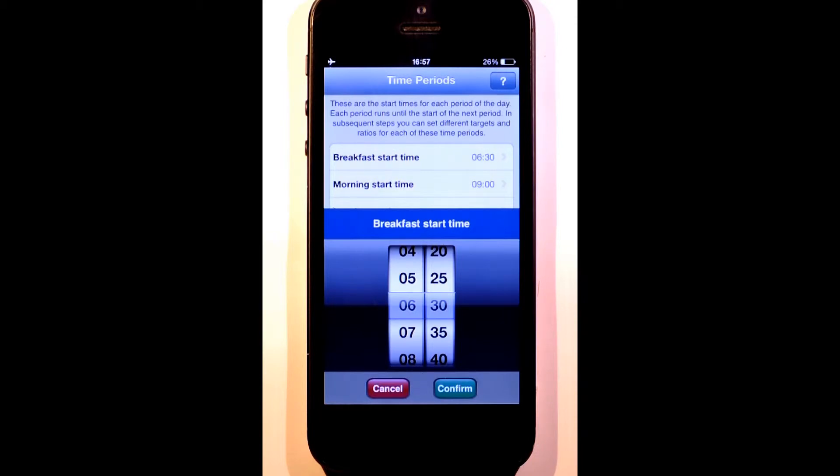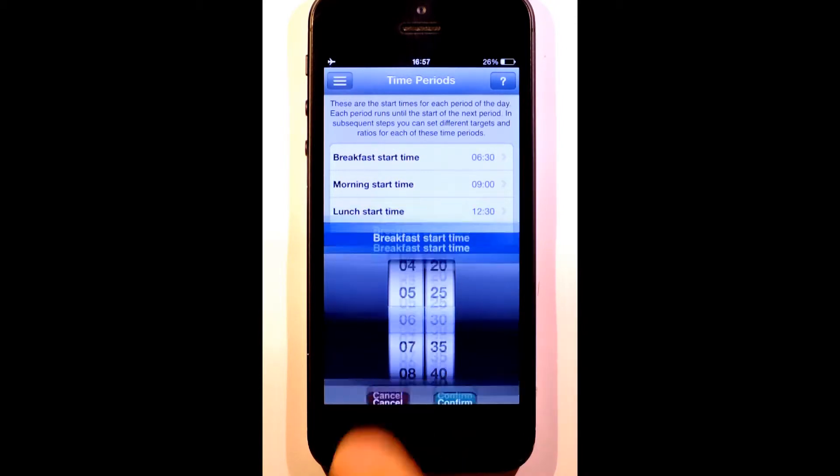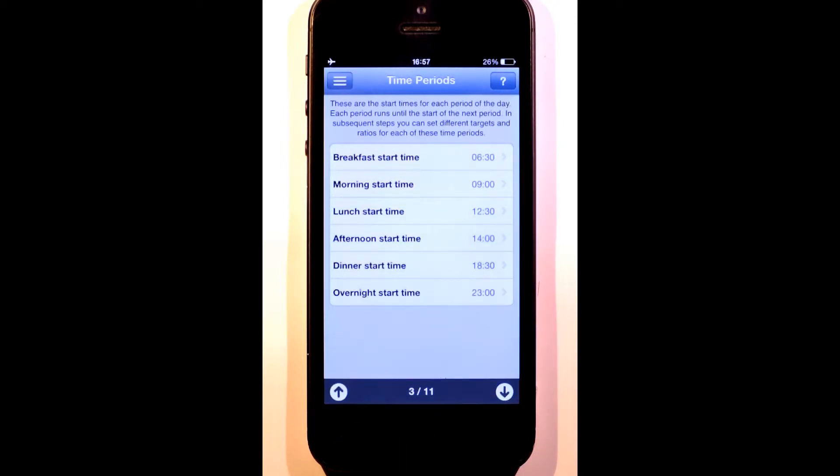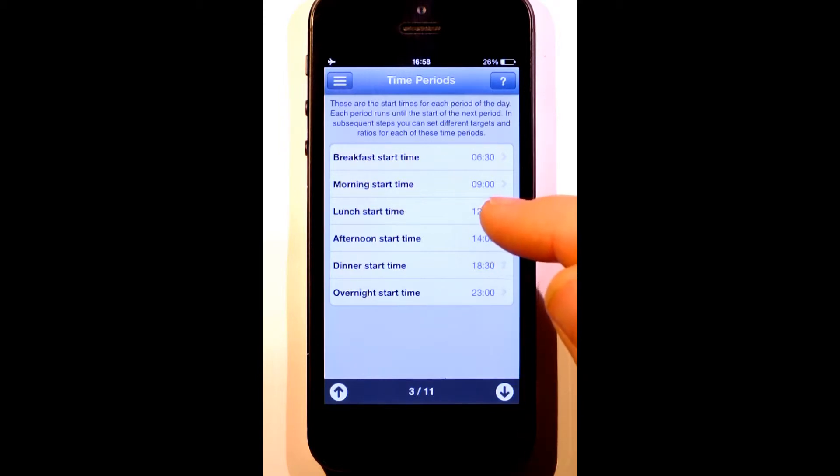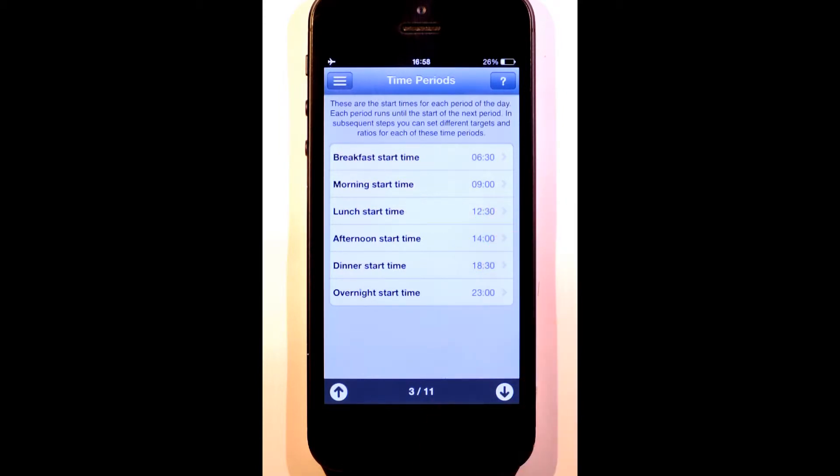Together, they cover a complete day or 24-hour period. For example, sometime between 12:30 and 2pm is when I have my lunch.